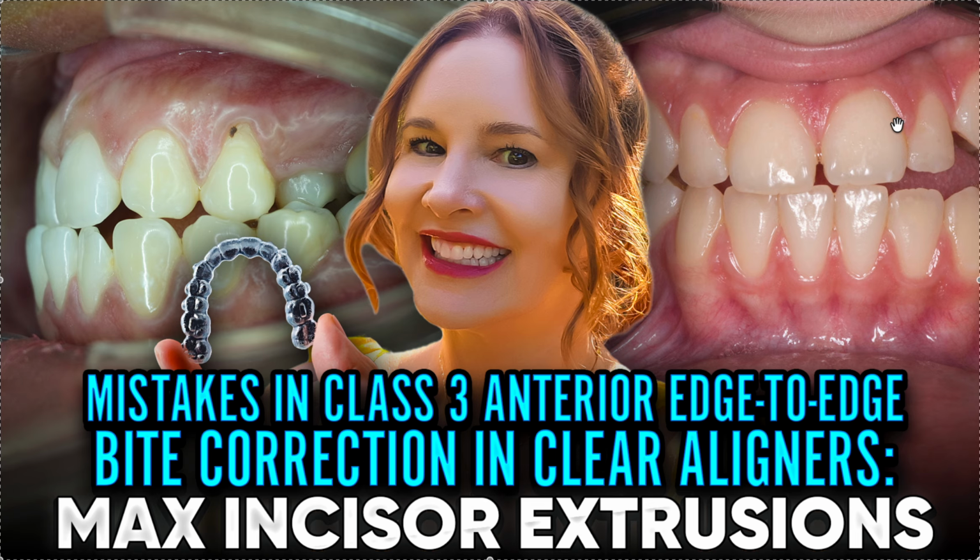The CBCT doesn't show me that. All it shows me is, is there bone for me to move these teeth forward or back, or out? That's it. That doesn't tell me anything else in terms of facial harmony, how this is going to work for the patient.